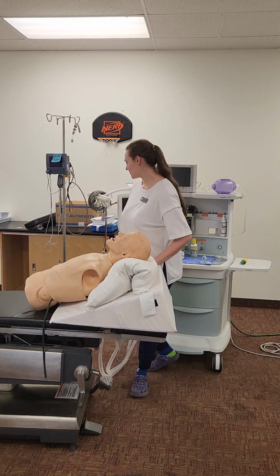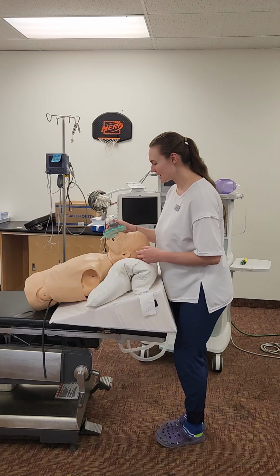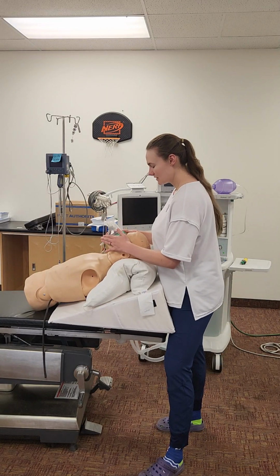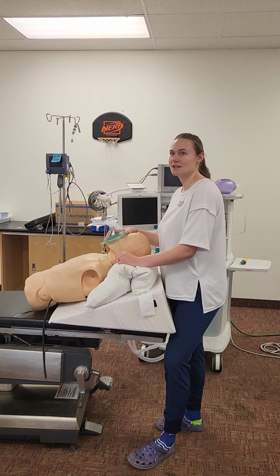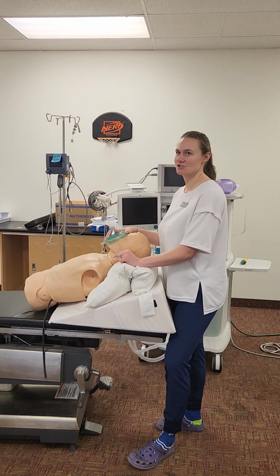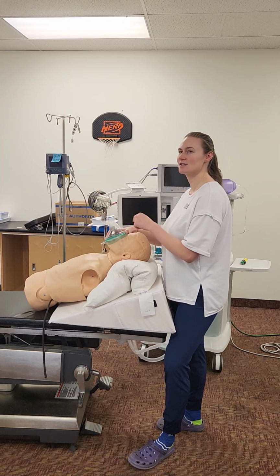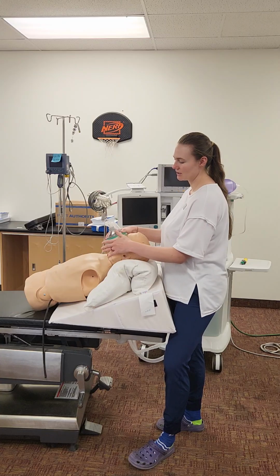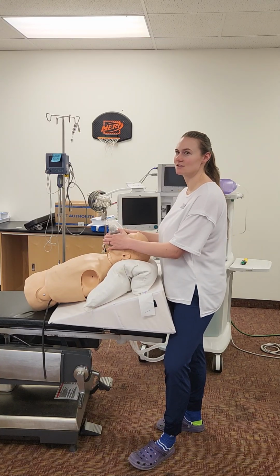And then once he's all situated and calm, I'll say, hey, this is a mask of just pure oxygen. I just need you to breathe really deeply, and this is just oxygen. I'll tell you if there's any funny gas going in there or anything. I'm just going to denitrogenate you and pre-oxygenate you at 6 to 8 liters per minute for a total of 3 to 5 minutes. So keep taking some deep breaths. I might need to use 2 hands. I might need to tegaderm his beard if you didn't consider shaving it, or put gel around my mask so that it will have a seal so there are no leaks.